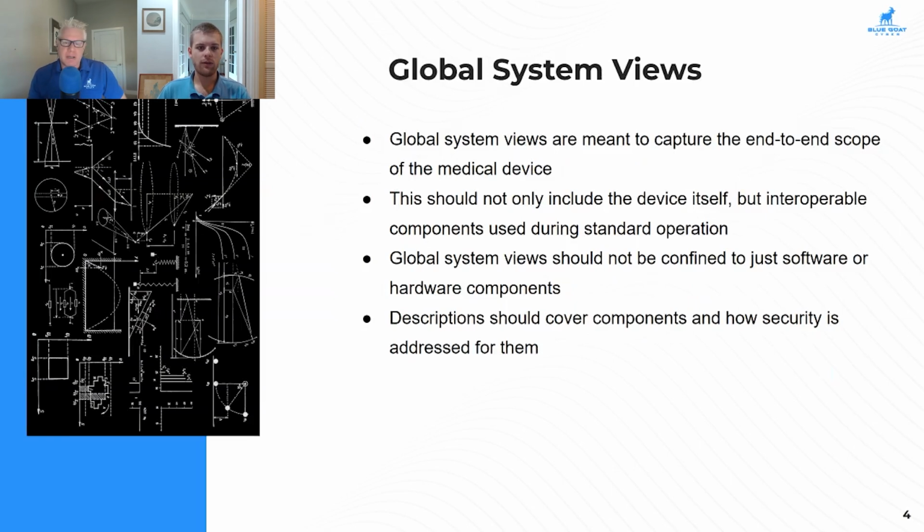This is basically all interactions, either through a human or data flows, so it's logical or physical interactions with the device, effectively. Yes. From anything it's supposed to interact with, and even things it's not supposed to interact with. Exactly. And this will include the internal components as well. So how are these internal components communicating and interacting with each other? So it has to be a very comprehensive view.